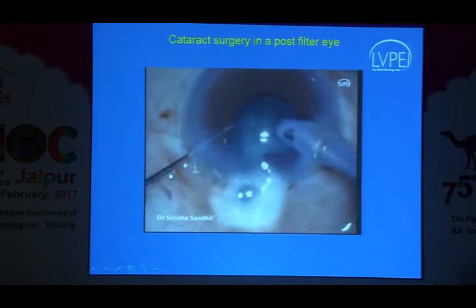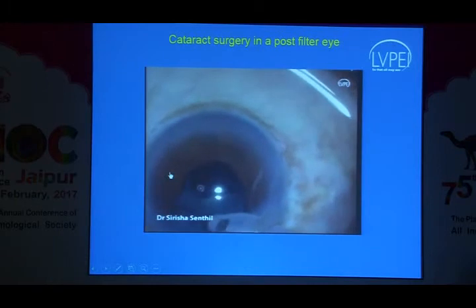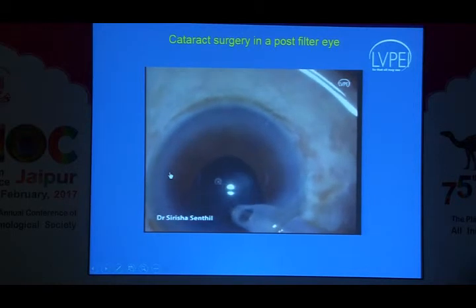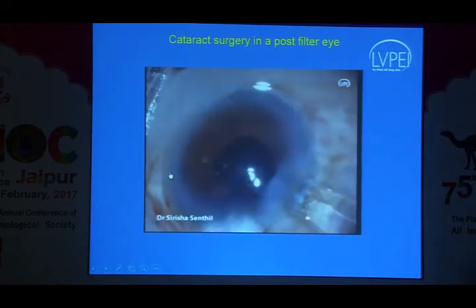And if you're using a blue dye in these eyes, blue can actually go through this and it can stain the conjunctiva. That's not going to really harm, but we don't know what its effect is on the bleb. That's something that you need to remember. Whatever technique is suitable for you to go ahead and do a phaco, do that. And once you finish that, like we said, you would definitely like to suture that wound because you have a leaky wound superiorly.